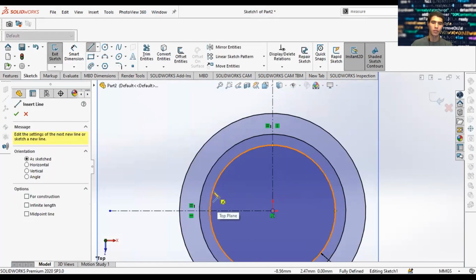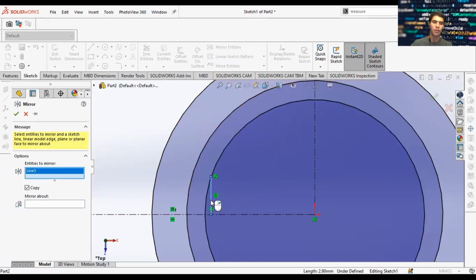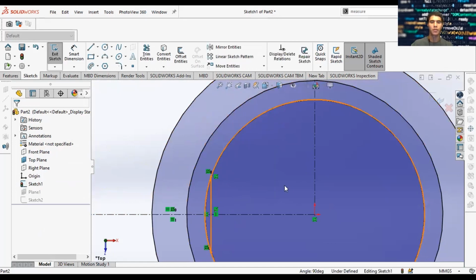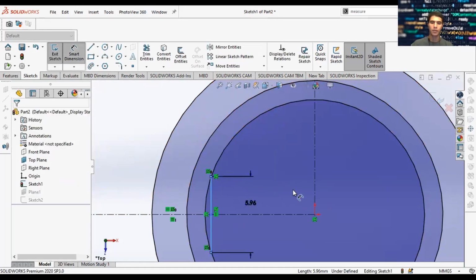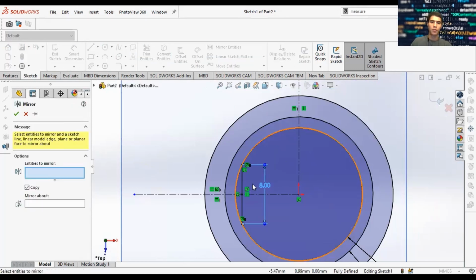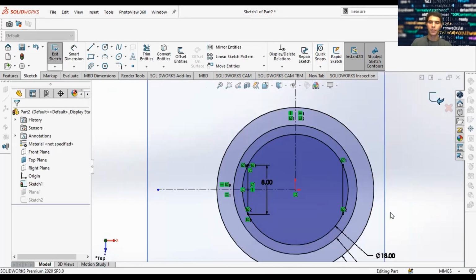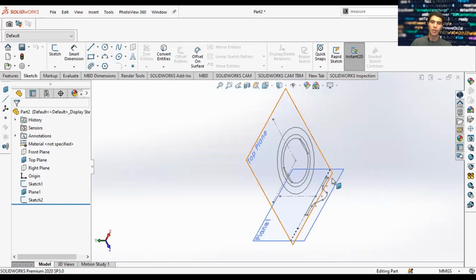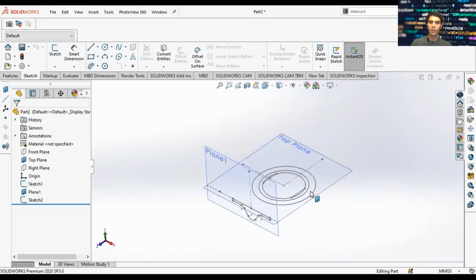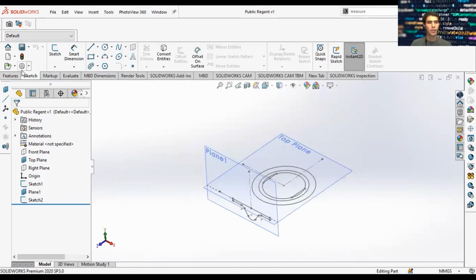I'm going to draw a line from here to here, and we're going to mirror this line without this reference. And now we're going to add dimensions to it. Make it 8 millimeters long. And then we'll mirror this line without this reference. And you'll see why this is important later. So what we have so far, let's roll this. We have our base and we have our side sketch. Let's save it. We're going to save this as, and we'll continue our features.